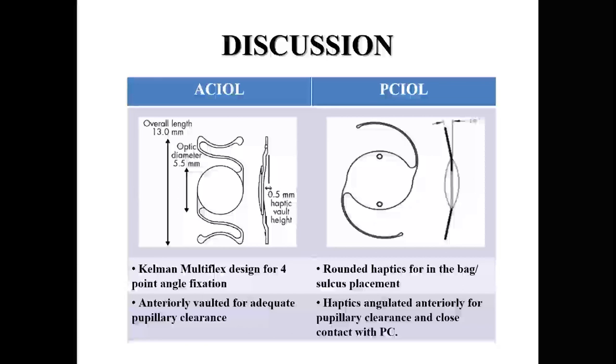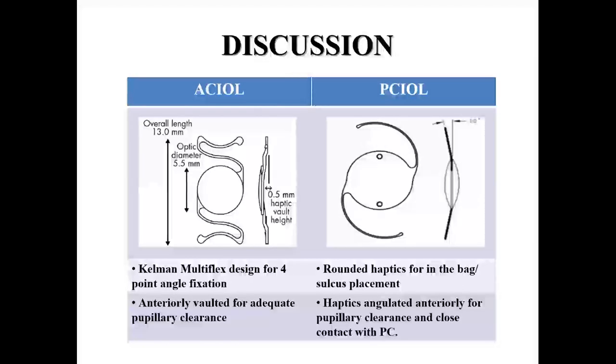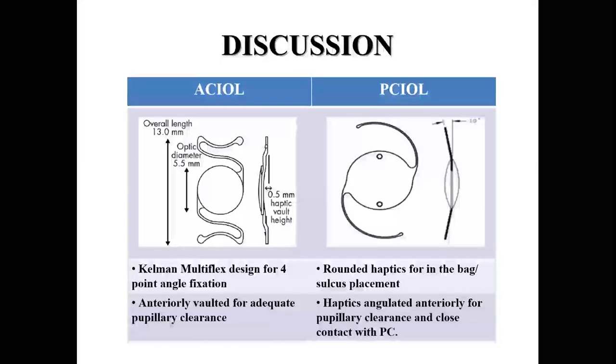So coming to the discussion, as you can see, the design of the AC IOL is a Kelman multiflex design, and it aims for a 4-point angle fixation. Whereas a PC IOL has rounded haptics for in the bag or sulcus placement. The AC IOL is anteriorly vaulted, the optic is anteriorly vaulted for adequate pupillary clearance.